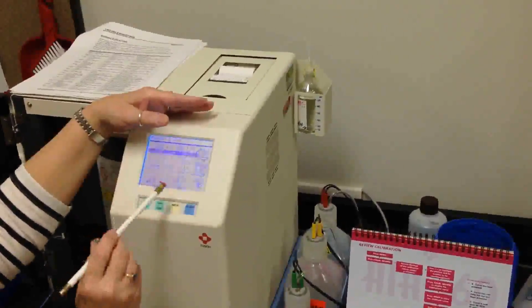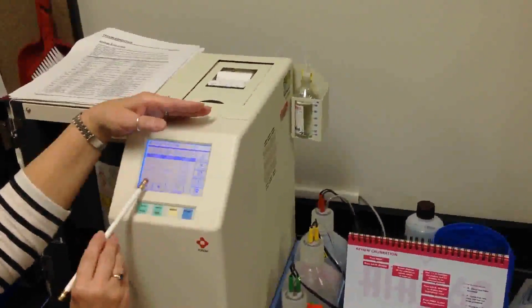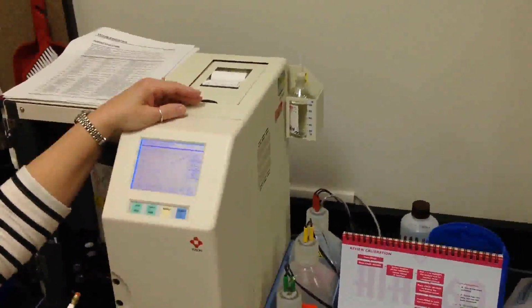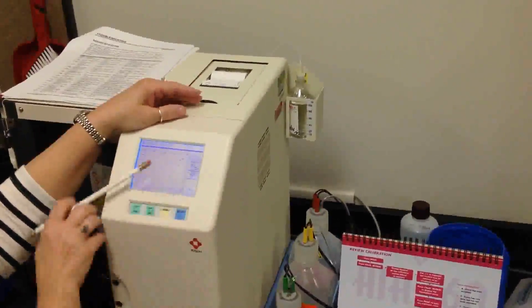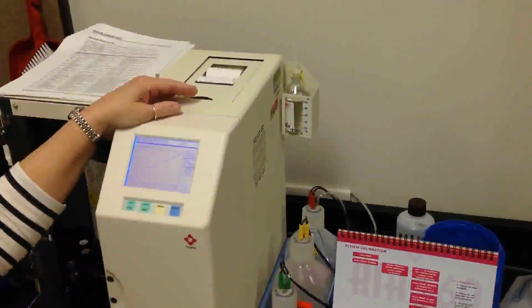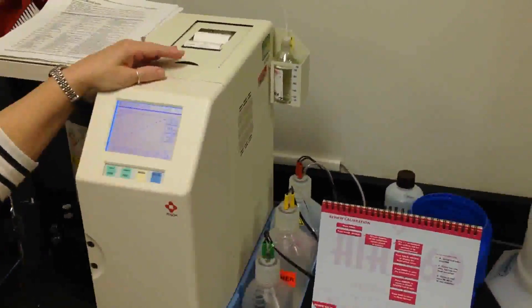Cal Review. Here's the current calibration. I want to calculate. Here's my curve. Now I want to accept. And because I removed the other 72 lot, it now has a place to store it.